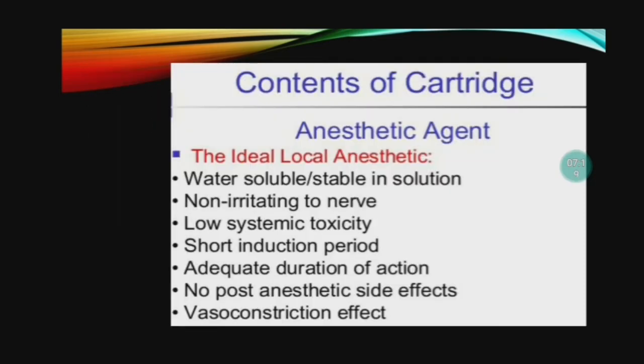So the contents of the cartridge: the anesthetic agent. The ideal local anesthetic is water-soluble, stable in solution, non-irritating to nerve, with low systemic toxicity, a short induction period, adequate duration of action, no post-anesthetic side effects, and a vasoconstriction effect.